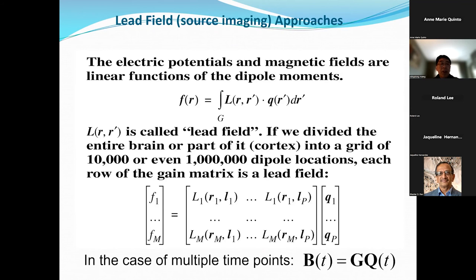So now we switch. With the nonlinear search you can only fit, say, one to five sources. In many cases, we know there are more than five sources. Currently in my brain, more than five groups of neurons are firing. I'm looking at the screen, I'm talking; my language network, my sensory motor network, my visual, auditory, all light up simultaneously. So I have many, many sources in my brain. The limitation of the one to five dipole fit needs some improvement.